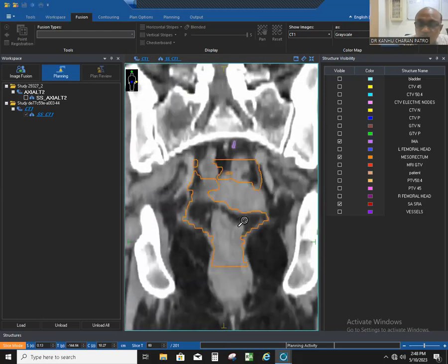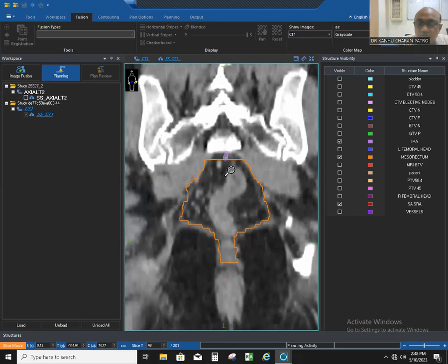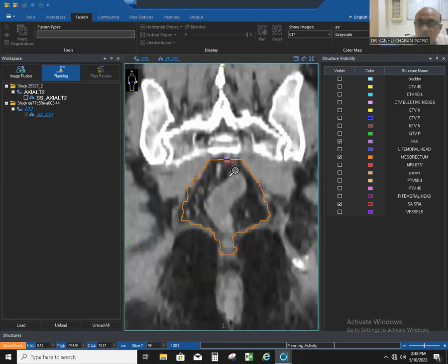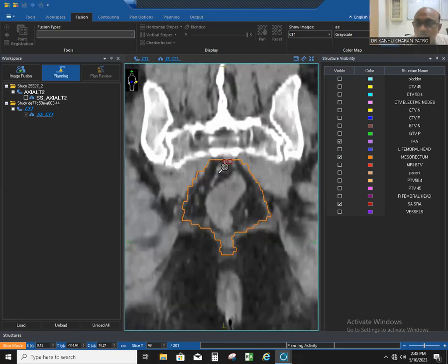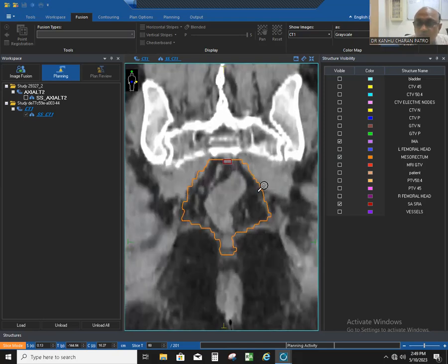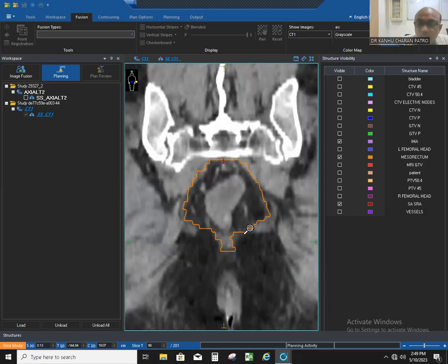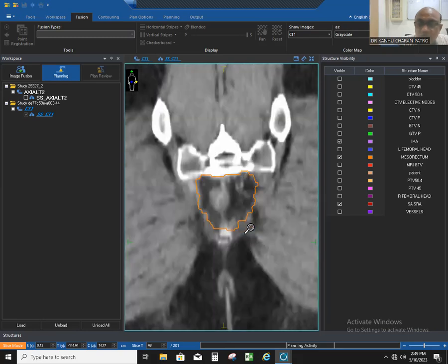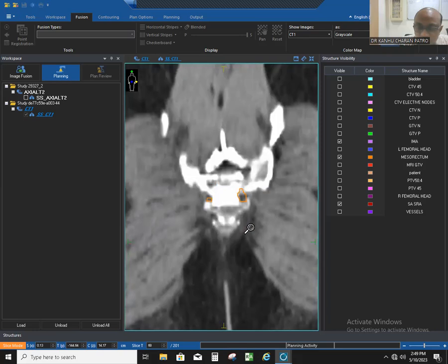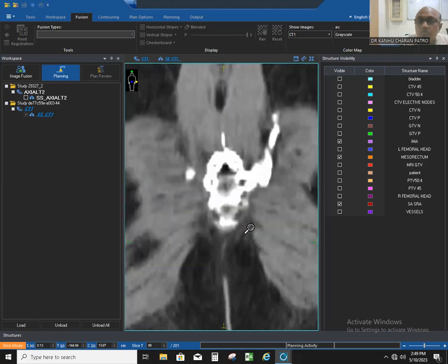This is how the mesorectum looks, and you can see the division of the two branches — the superior rectal artery and sigmoid artery — marking the upper border. Laterally is the mesorectal fascia, anteriorly the pelvic organs, posteriorly the sacrum and coccyx, and inferiorly the merging of the levator ani with the rectal walls. Thank you very much.